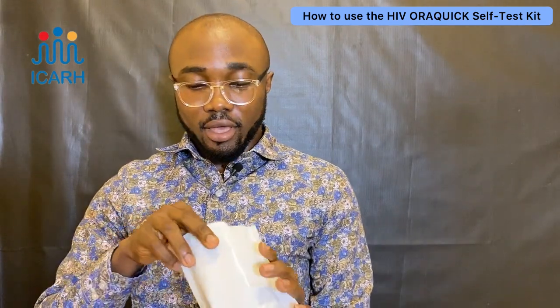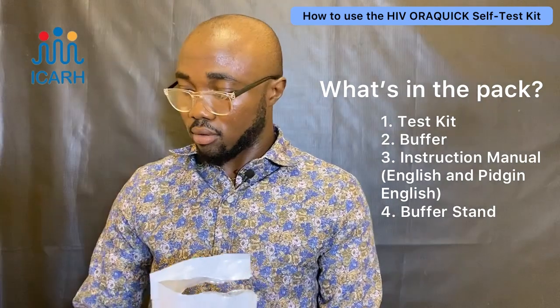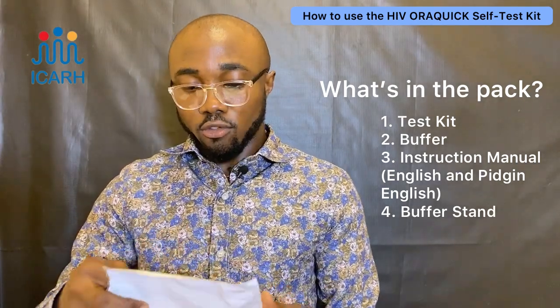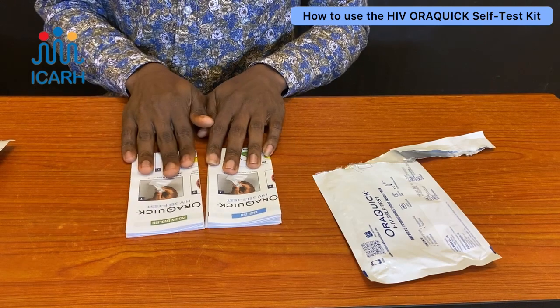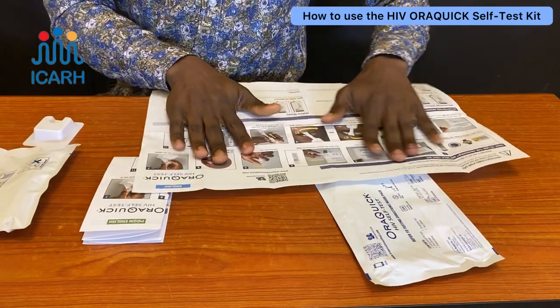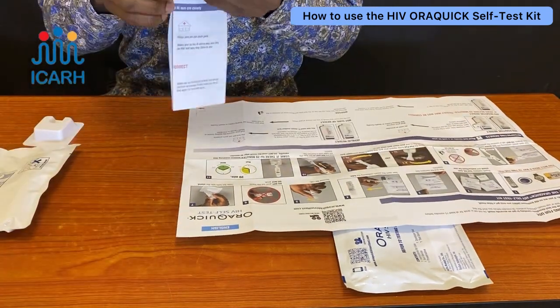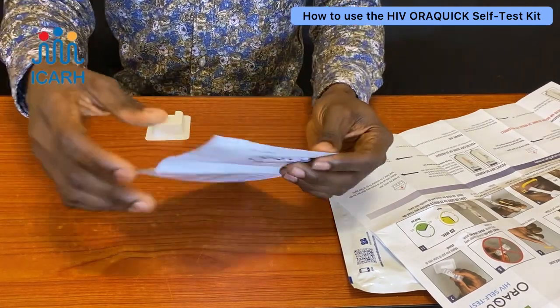Inside the box we have the test kit itself and a buffer — I'll explain what that is shortly. We also have an instruction manual — please make sure you read it — and a stand for the buffer. The manual comes in both English and Pidgin versions, and there are pictures to help guide you in using the test kit.